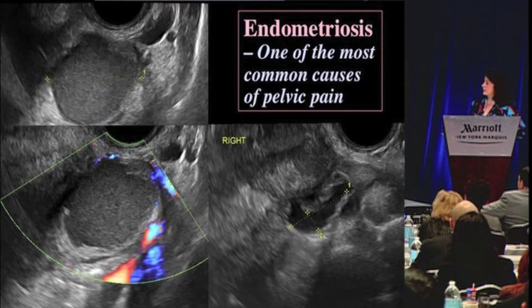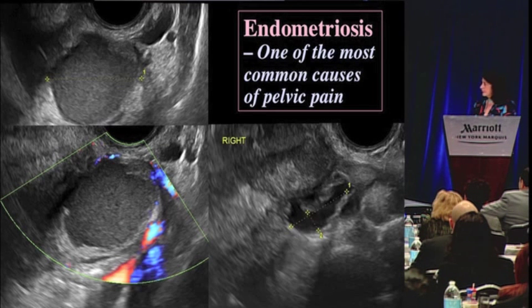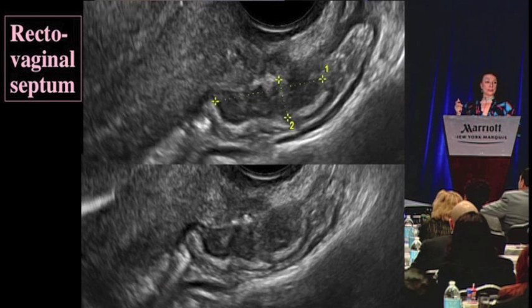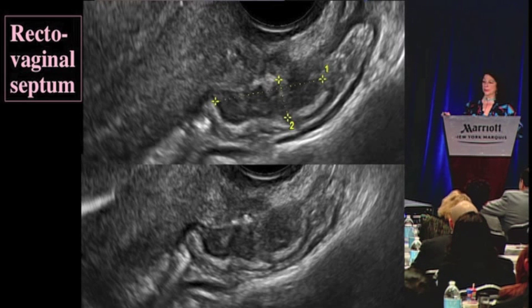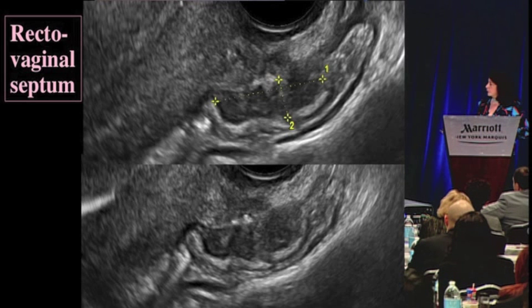Going on to endometriosis — this is a typical endometrioma. It's a cyst and it has this ground glass appearance. It's often associated with a hydrosalpinx because it makes for a lot of adhesions and stickiness in the pelvis. What ultrasound has gotten very good at recently is seeing the implants of endometriosis in the bowel wall. This is a loop of bowel here, this is the lumen of the loop of bowel. This is the normal wall on this side, and that wall is all nodular and thickened. You can see it here — these are implants of endometriosis.